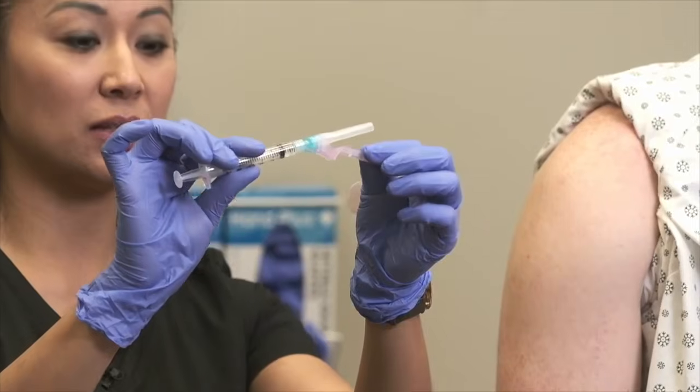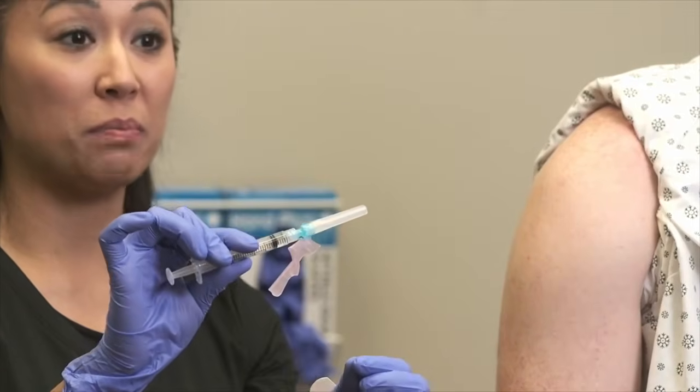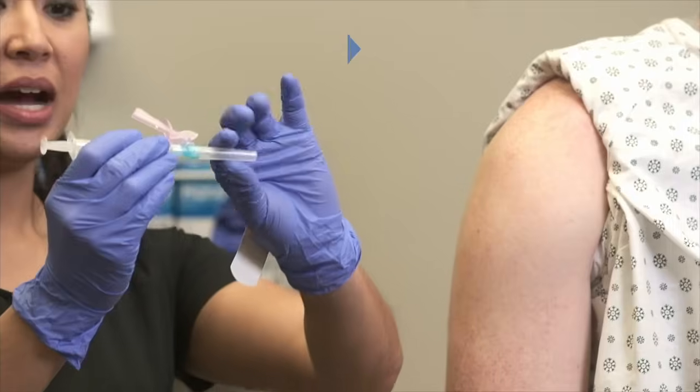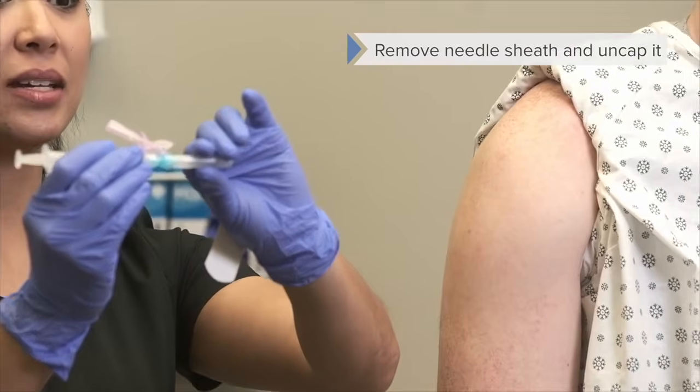All right, so when I go give an injection, with the needle that I'm using, there's a safety device, which is a great thing. We just want this out of the way for injection. So I'm going to move this device, and I'm going to pull this all the way back, so that way it's out of the way of the needle. Then anytime I go give an injection, notice I've got a firm grip and a dart-like grip on the syringe itself. So now that we've got that ready, I'm going to take the sheath of the needle and uncap it. I've pulled this away from my body and away from my patient.